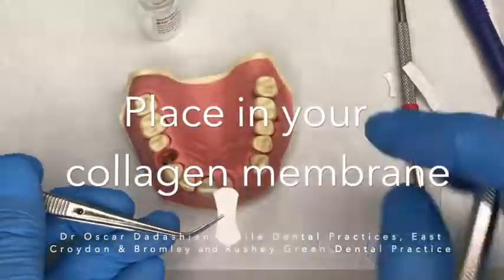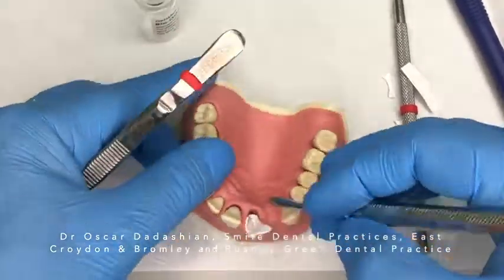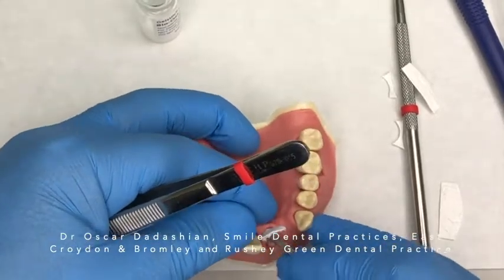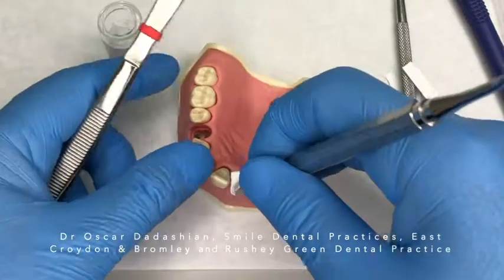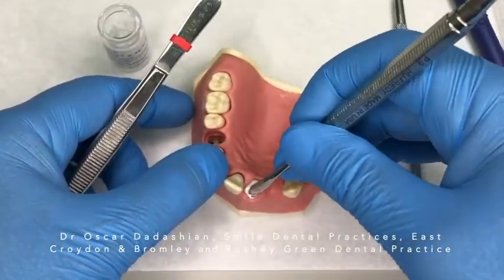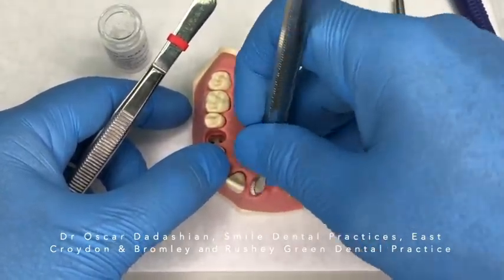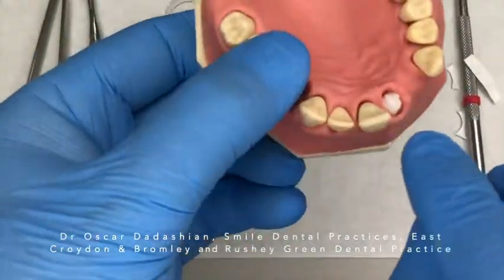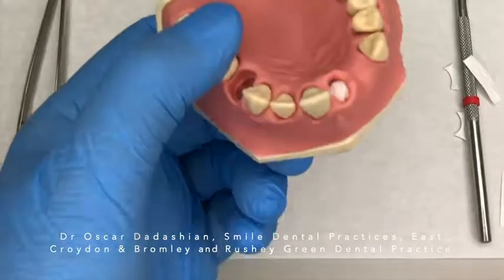Now we are ready to cover the grafting material with the collagen membrane. I start with the palatal surface, gently tuck it in to that pocket I created, and then tuck in the buccal surface very gently. All of this is done with care without damaging or penetrating through the soft tissue. The grafting material and the collagen membrane now look nice and neat, with the edges tucked in.